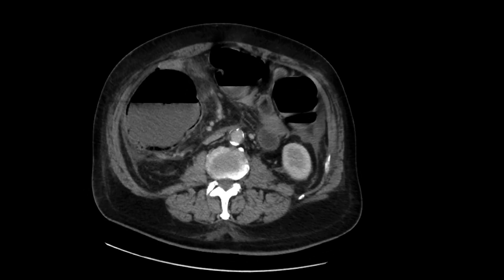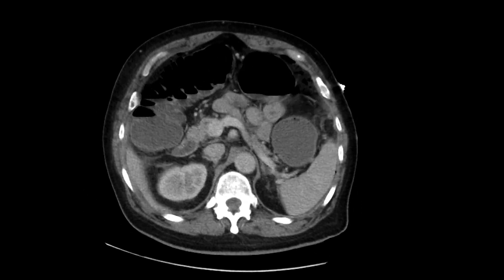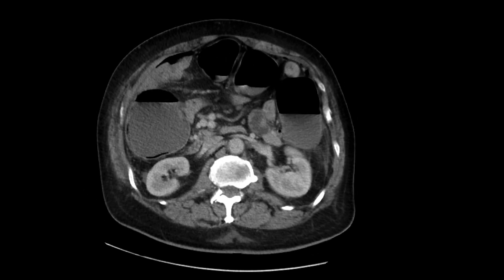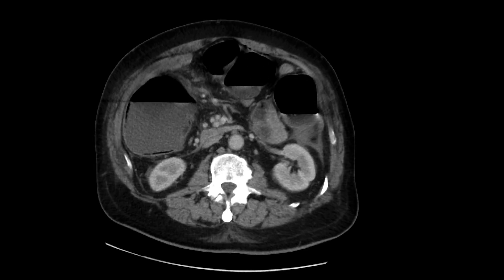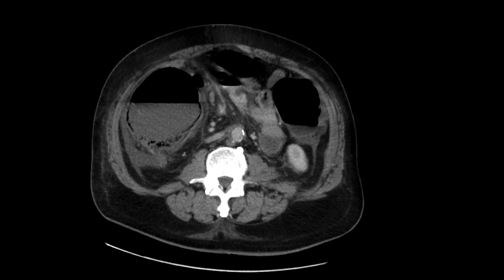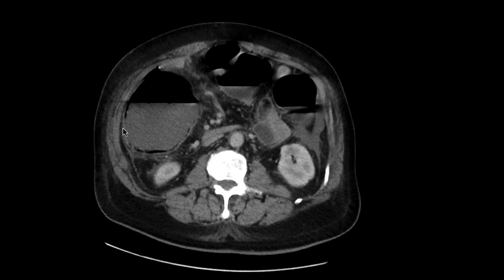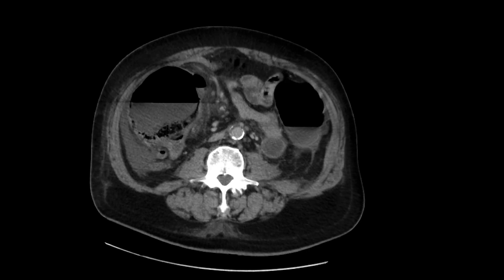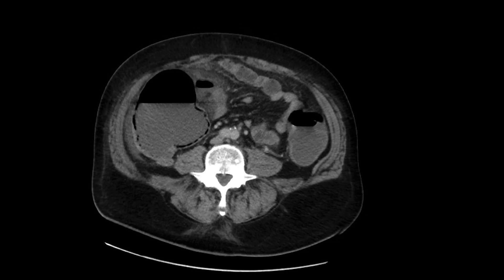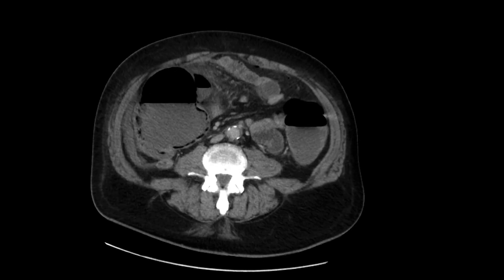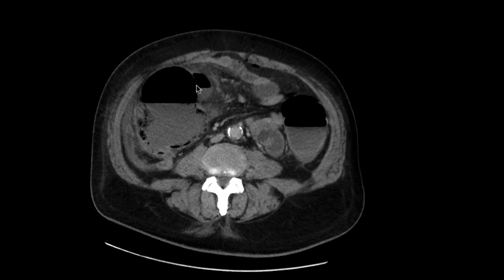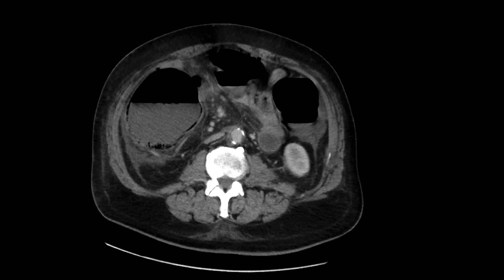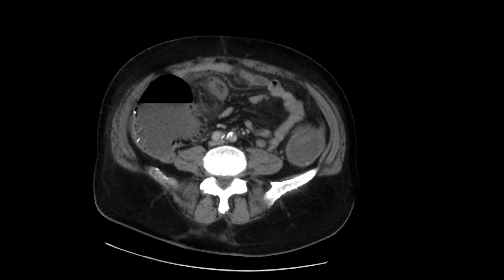In terms of the pneumoperitoneum, there is certainly some pneumoperitoneum over here. If we look at the cecum, it's quite distended and fluid filled. We can start to see that there are dependent areas of gas within the bowel wall — this is a good look for pneumatosis. And we can also see that there is an air-fluid level closely associated with this loop of bowel.